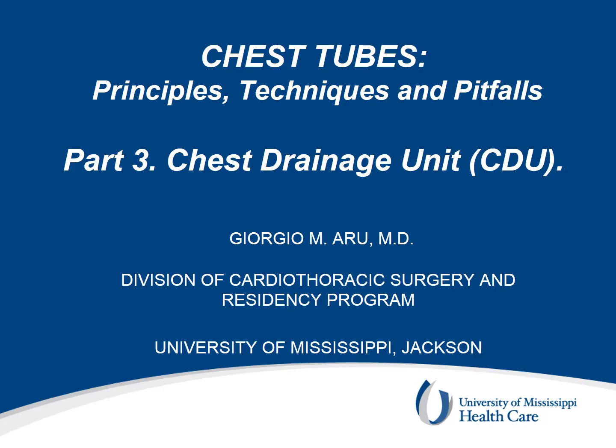Part 3 of this talk is about the chest drainage unit, also abbreviated as CDU. This is the collecting chamber where the air or fluid drainage from the chest will go. From this unit we can get very valuable information about the patient's chest physiology.